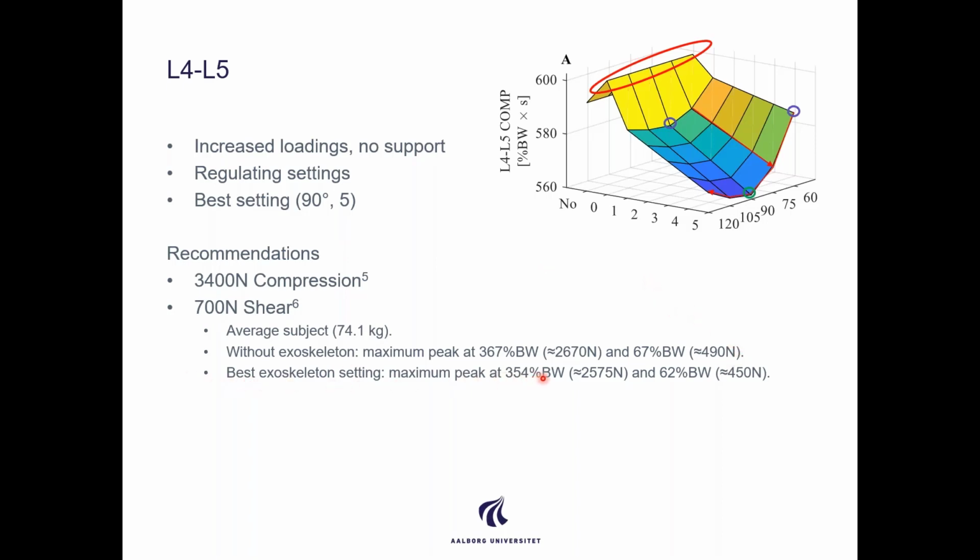And then we could see that when we are using an upper extremity exoskeleton, which is usually for the shoulder complex, we could actually also reduce some of the loading in the spine, which is of course a great accomplishment for an upper extremity exoskeleton.